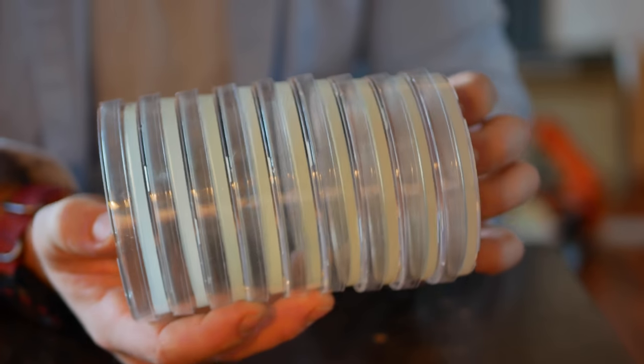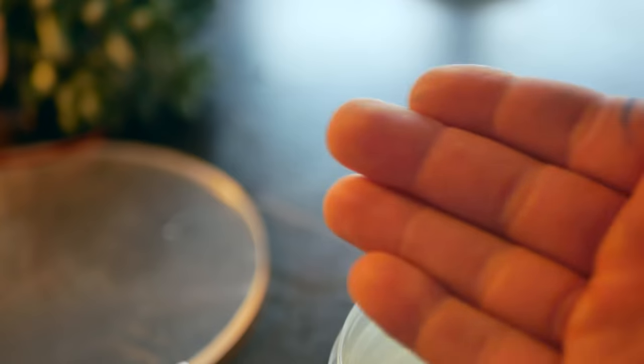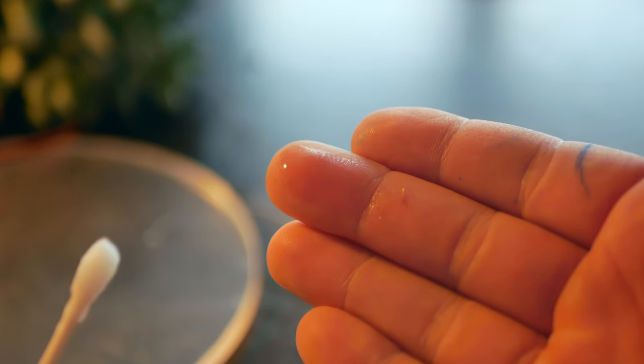So if the wand creates cold plasma, it should be able to sterilize surfaces without burning them. To test this, I'll be using 9 bacterial growth plates. Each plate is fully inoculated with bacteria, which I collected from my grimy hands. No one will shake hands with me after this.